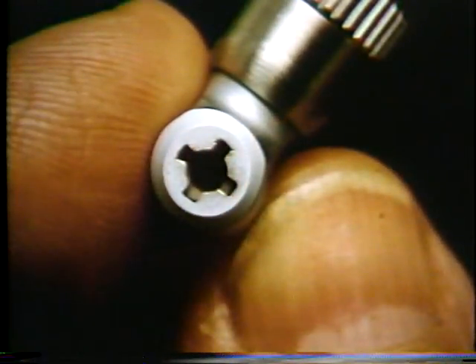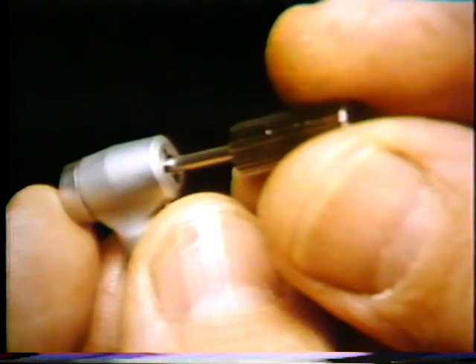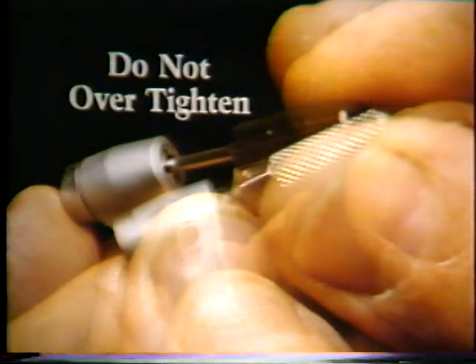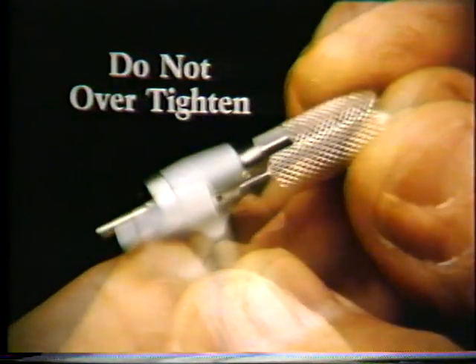Reinsert the grip part of the chuck in the side of the head with the 4 notches around the hole. Slide it into the hole with the pusher tool until you feel resistance. Then place the non-threaded end of the other part of the chuck into the hole. Tighten it down with a burr tool until the top of the chuck is even with the surface of the contra-angle. It's important not to over-tighten, because this will push the ends of the grip part of the chuck together and you won't be able to insert a burr.